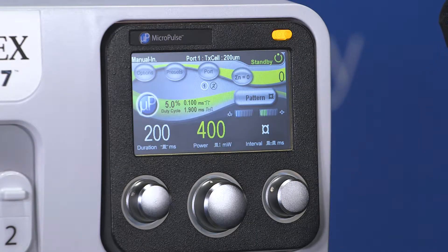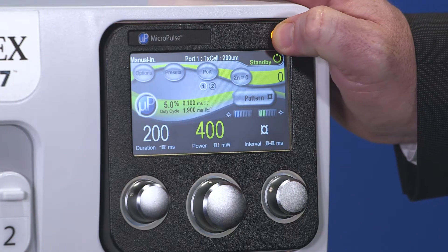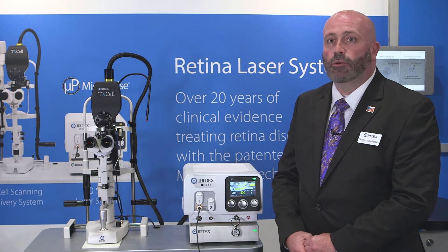You now have a pattern selected. The last step is to press the treat and standby button. Once you press that button, the green light will blink four times. Once it turns solid, you are ready to treat. If anyone touches the pedal prior to that light turning solid green, the laser will revert to standby.